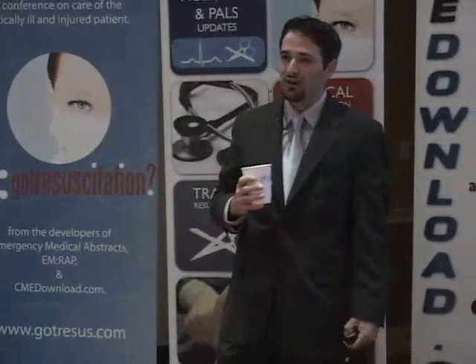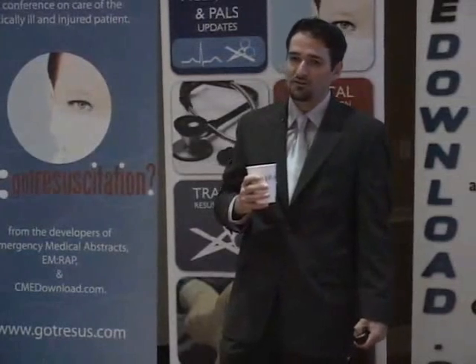All right, bowel gas, I said it's your enemy. You need to know how to avoid this. Otherwise, a lot of your scans are going to be inadequate. So gentle, steady downward pressure. Just try to manipulate that gas out of your way. Don't give up. Spend some time with it. You can try to angle around the gas by going slightly to the left or to the right. And you can also try scanning coronally from the side to avoid the gas entirely.